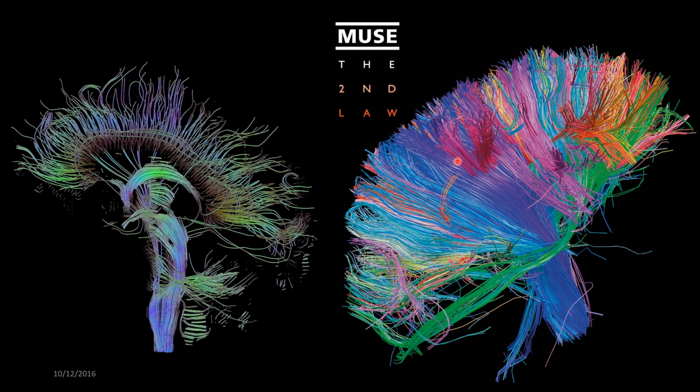It was developed quite recently, I think 2007. Don't quote me on that, though. What it allows the MRI scanner to do is to look at the actual nerve fibers that interconnect the different parts of your brain in very, very high detail. So the Muse Second Law album cover was not just a fancy picture of the neural fibers in your brain, although most people probably didn't know what that was, but it is a legitimate picture.